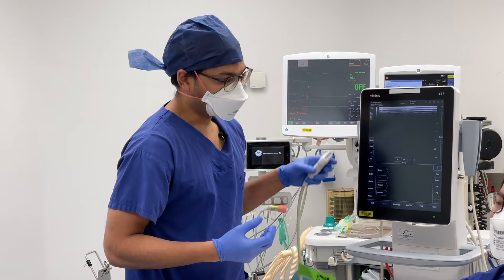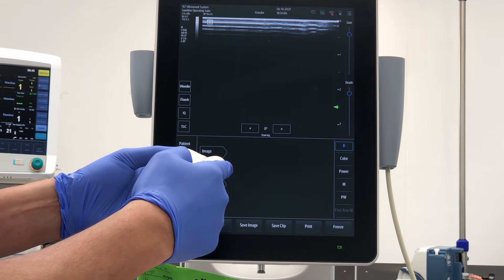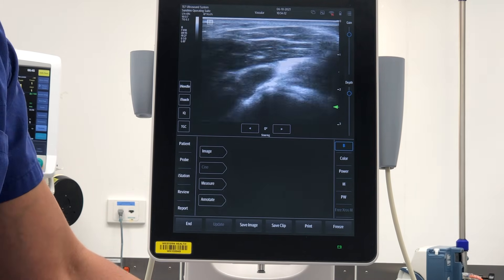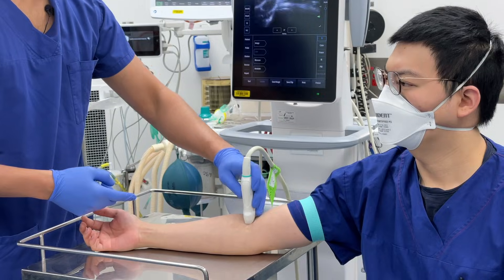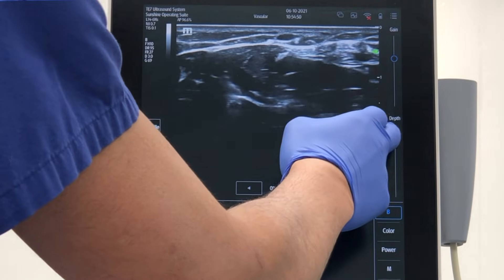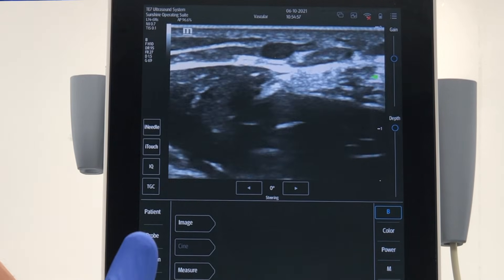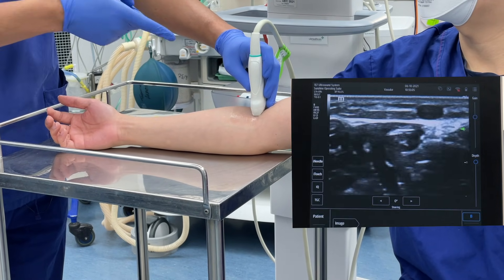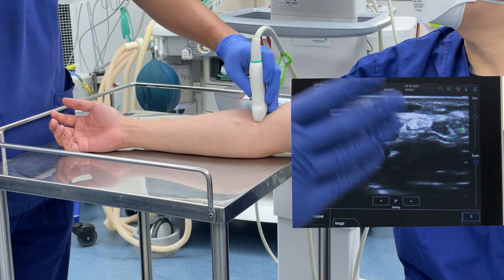The first thing I do is always check the orientation of the probe — I just touch here with a glove and make sure I get interference on the correct side, so I know the probe orientation. Now I'm going to scan. You'll see that veins are generally really superficial. I've got a vein here that's pretty superficial, so I'll decrease the depth. What you can see is this hypoechoic — black — structure that's elliptical, which means it's probably some kind of vessel.